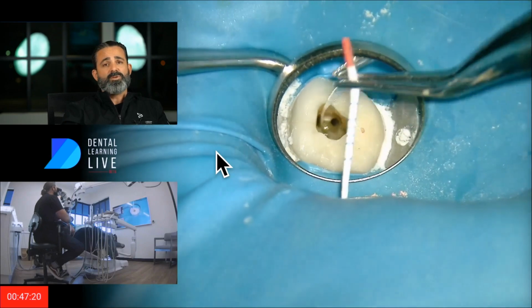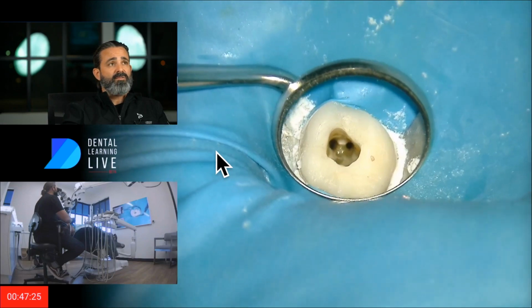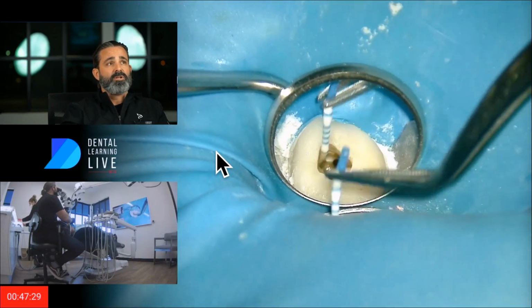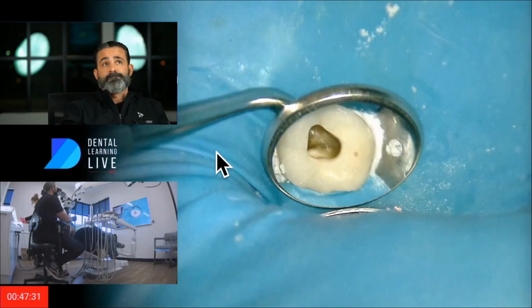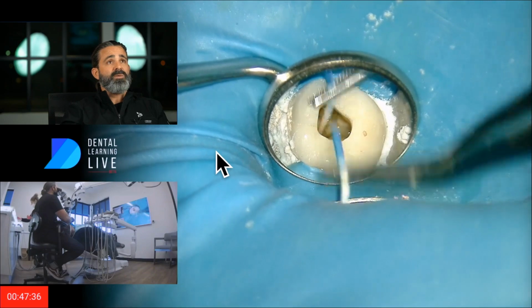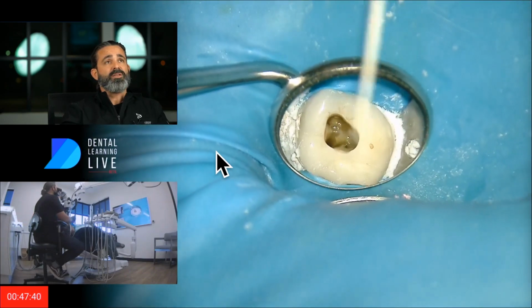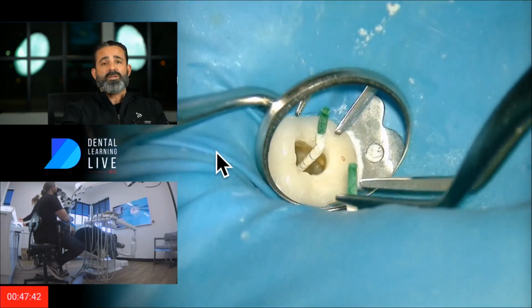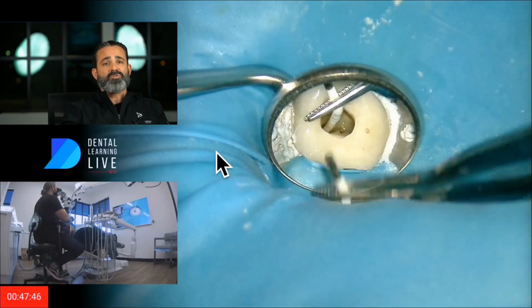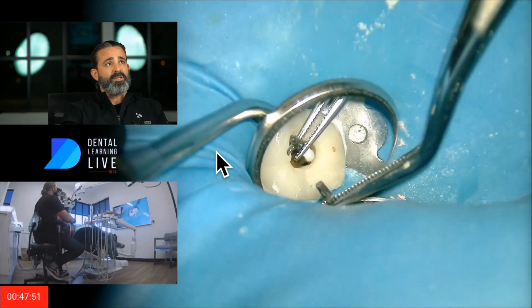But this is one I'm going to follow up with you all on and see, because I've gotten a lot of questions on that and people wanting to show that. And so I thought, what's best than an aged, good endo gone bad, good endo that didn't work, and can we make a difference? I've got enough cases in my arsenal to say yes, but rather than do hindsight 20/20 in showing you radiographic resolutions, I want to show you treatment resolutions via video. So that's the point of this case.